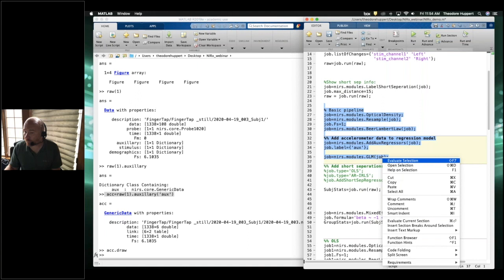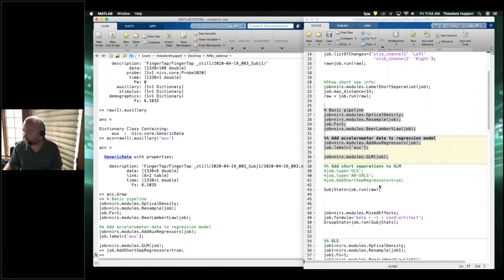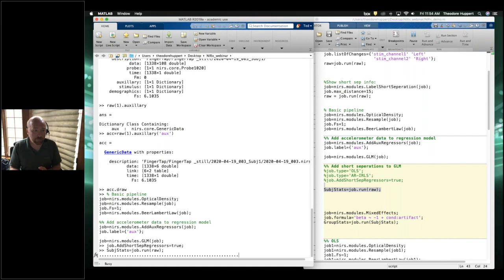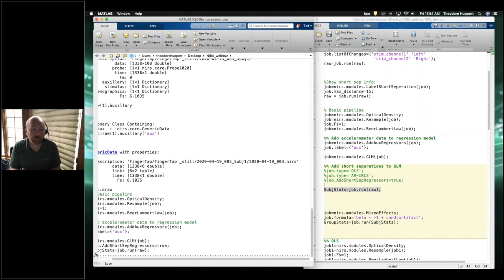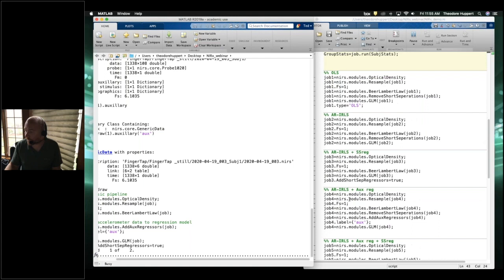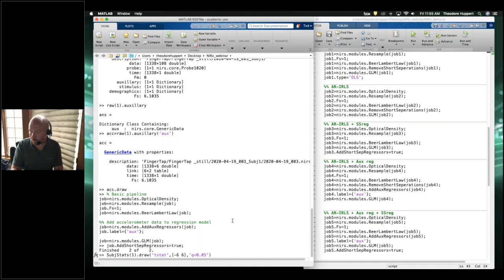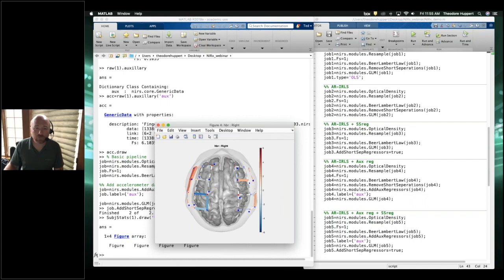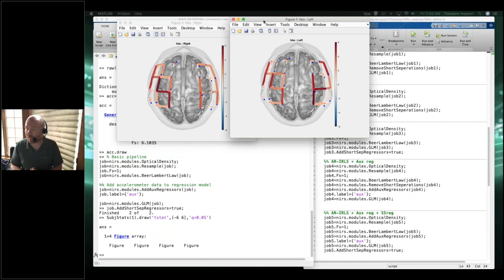Setting job.add to true and running the pipeline again: now the GLM model has the evoked response from stimulus timing, the short separation data being partialed out, and the accelerometer data also being partialed out. Running it on the first file — the one without motion artifacts — we basically get the same result.